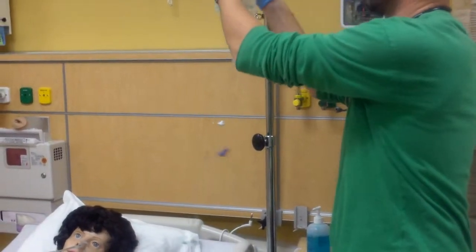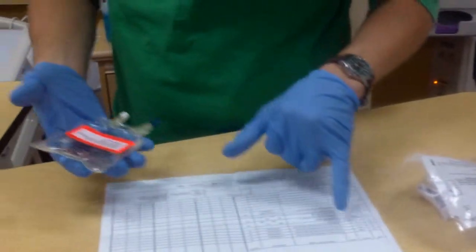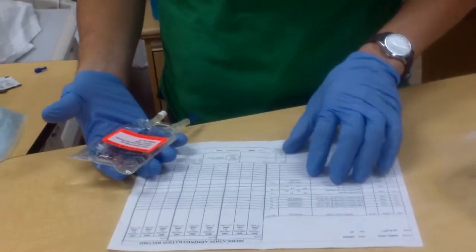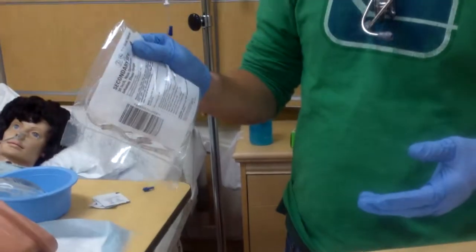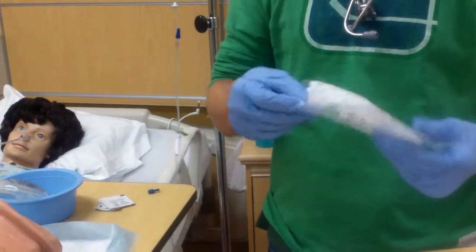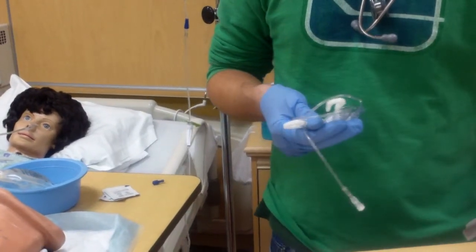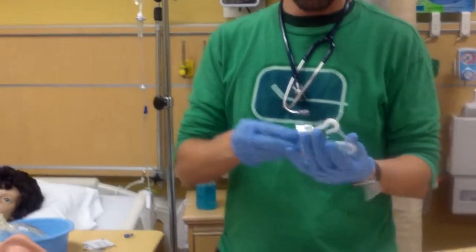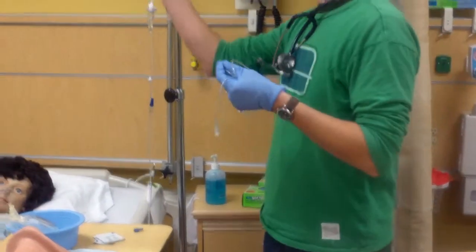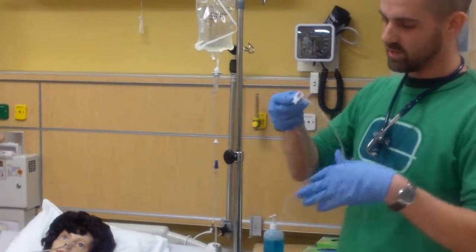Alright. Hang that up. Now I need to do my third check for my gentamicin. I have the right patient, the right time, route, dose, and medication. So that is good. Still no precipitates, not leaking. I need my secondary set for my piggyback, so I open that up. Expiration is good. Integrity of the package is good. And I'm also going to notice the drip rate, so when I can do my calculations, I will set the appropriate drip rate. So I have my little hanger here, hang that up. I'm going to clamp my tubing here.